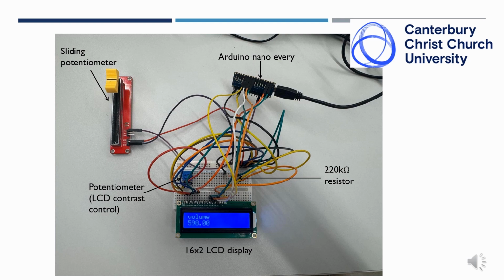In the physical circuit, the Arduino Nano microcontroller is used in the spirometer device due to its compact size. The linear sliding potentiometer works as a sensor to record the user's exhalation data in the form of an output voltage dependent on the movement of the slider. The LCD screen digitally displays the forced expiratory volume in 1 second of the user, showing an FEV1 value on the display screen.